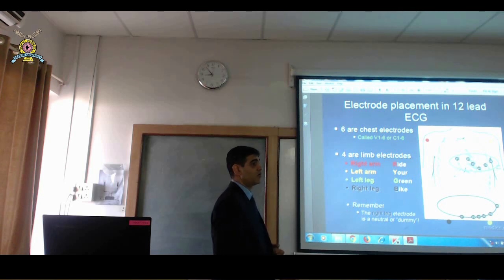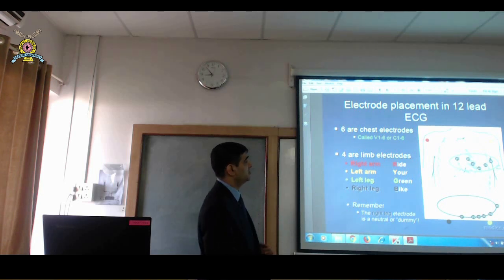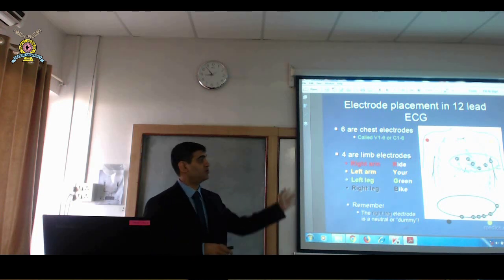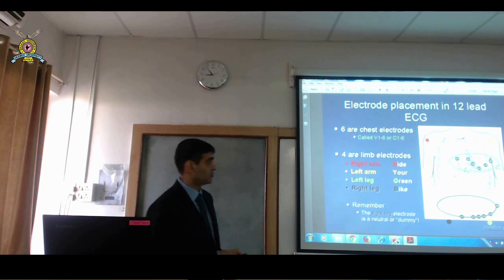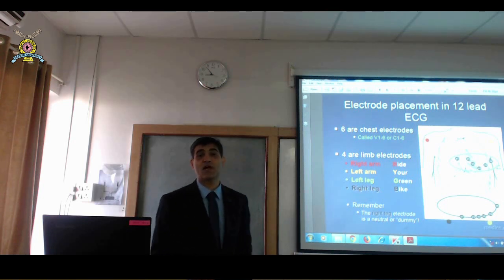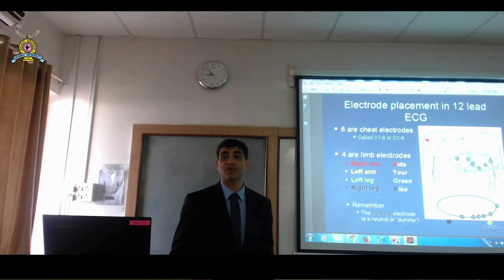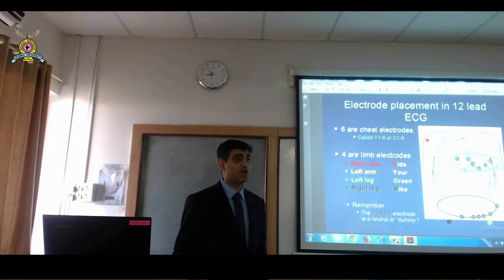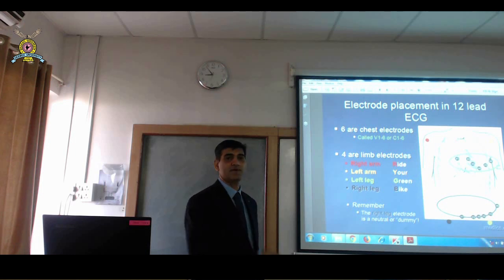Now, the only important thing in this is V4R. Only one electrode you have to remember. I don't want to do everything. The only important electrode is V4R. So if you put this V4 in the right-sided position, and you see ST elevation there, it is suggestive of RV infarct. Suggestive of RV infarct. If you want to check for RV infarct, you put the V4 on this side.